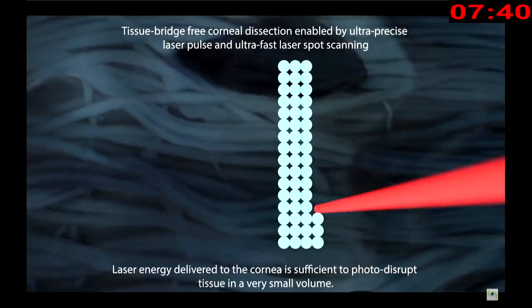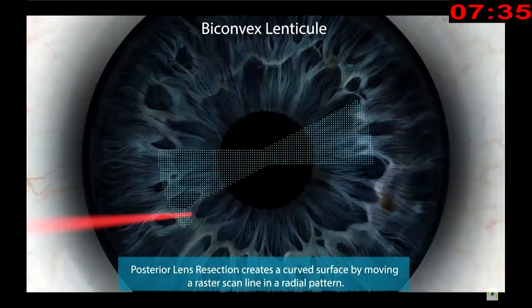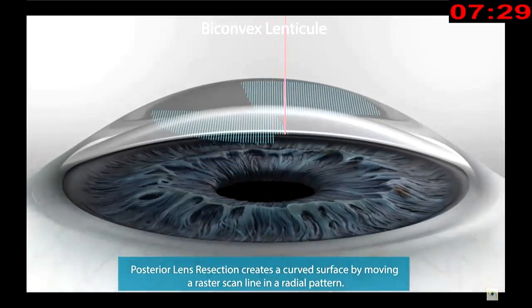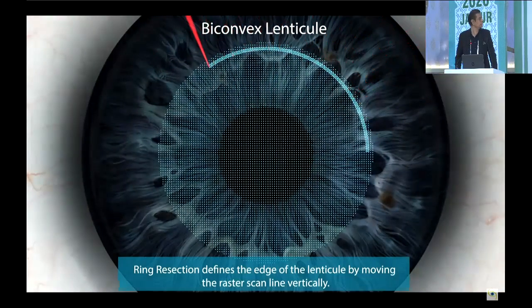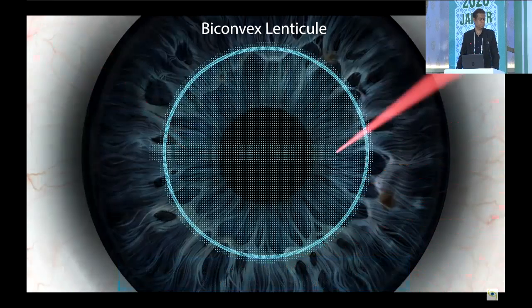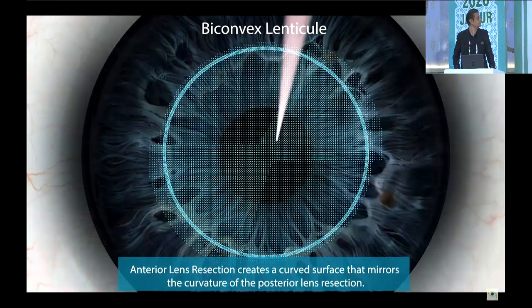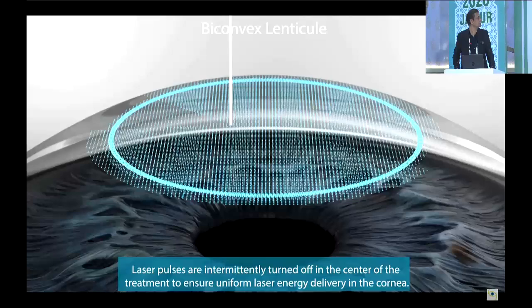Laser-assisted lenticule extraction procedures involve a small incision in the stroma followed by lenticule removal, thereby avoiding epithelial defects, postoperative pain and dryness, with faster wound healing and greater functional optical zone. Elita SILK is the latest new generation femtosecond laser from Johnson & Johnson Surgical Vision. It has received CE approval for smooth incision lenticule keratomileusis.